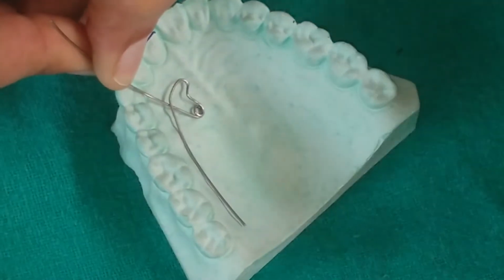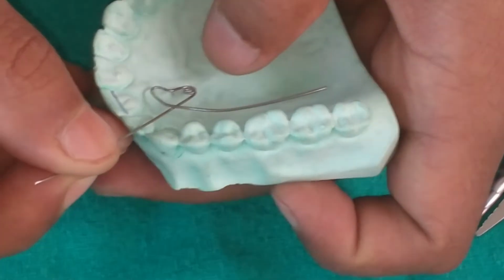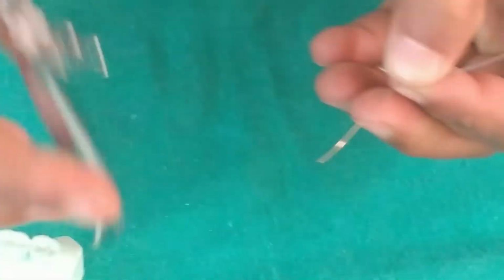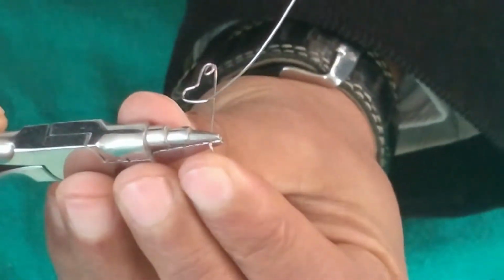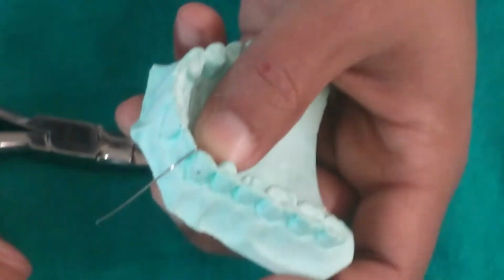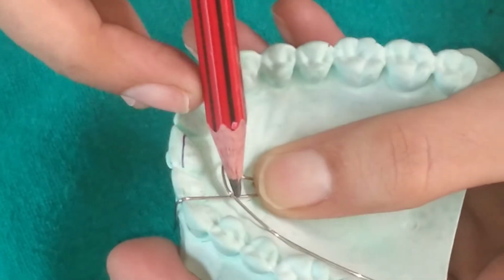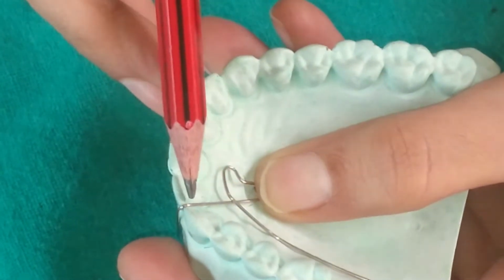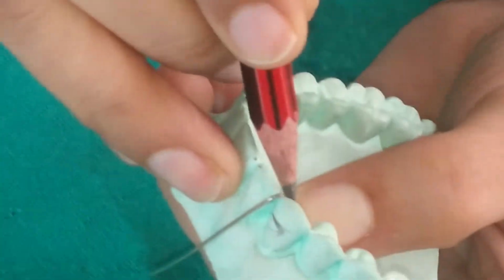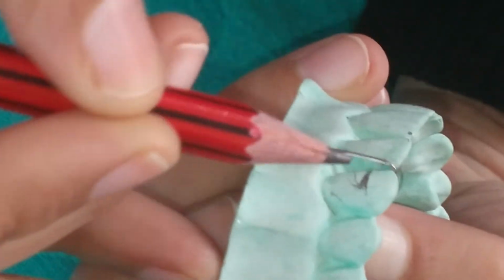Now we will adapt the active arm, which is tissue side. Now the active arm is adapted so that it passes from the mesial embrasure of the canine or mesial side of the canine. And we have to bend more. Now this active arm lies mesially to the canine or along the mesial embrasure and just passes to engage interproximally. This active wire just passes interproximally and is adapted buccally to the mid of the canine as a hook.